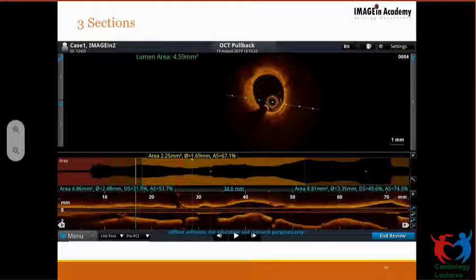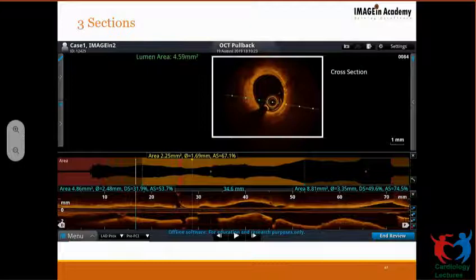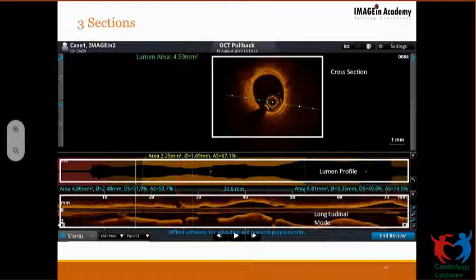Now, this is without co-registration. You have three sections. You have a cross section, you have a lumen profile, and you have a longitudinal mode. So it's very important, as you see in the lumen profile here, you see a small red dot in the middle. Now, this small red dot in the lumen profile indicates that there is a branch which is coming out. So if you have multiple septals and diagonals coming out, you will have multiple red dots.